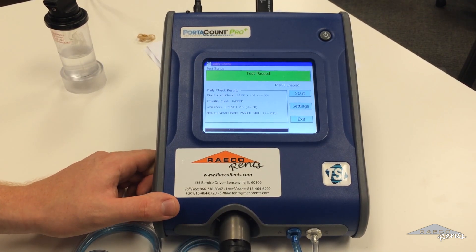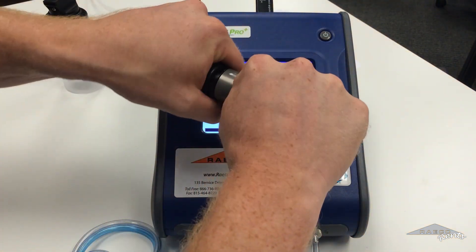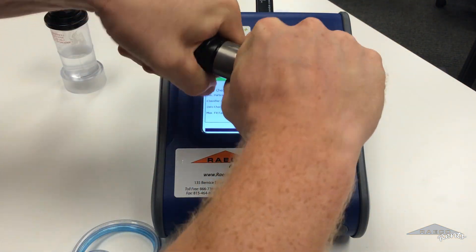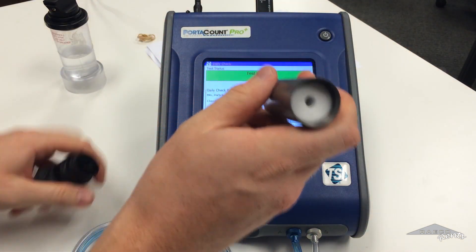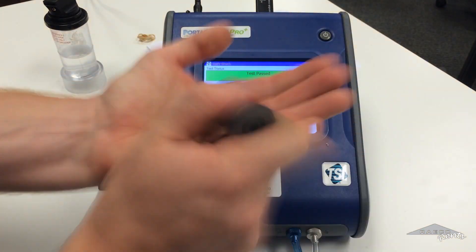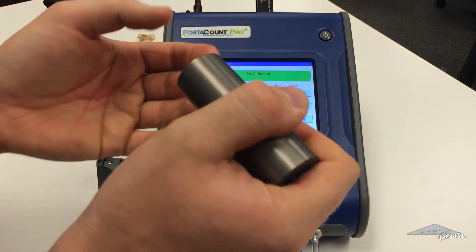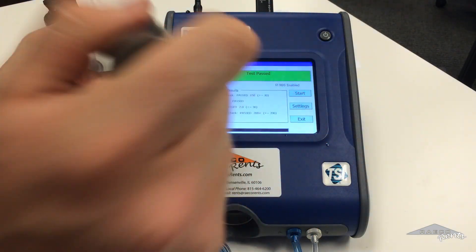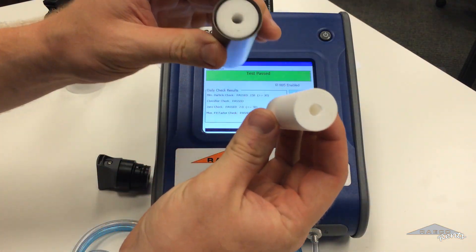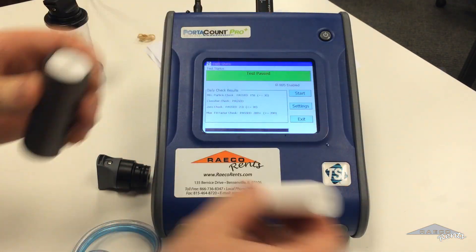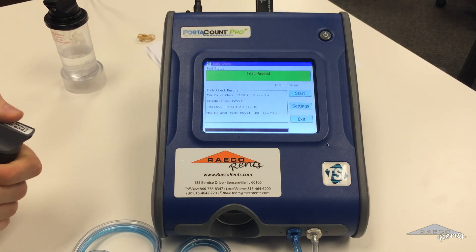I'll show you real quick — this is the alcohol cartridge. Swapping out that wick: you just pull this piece off and the wick is in there, and you can just kind of pop it out. It's a little bit more difficult than I'd like, but you'll just pop this out and pop a new one in real easy. And that is the daily check.